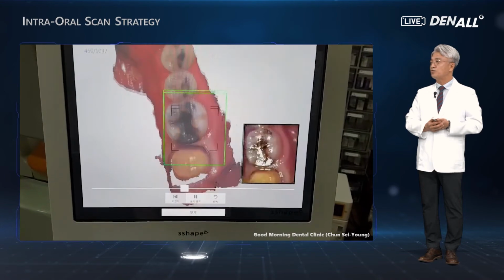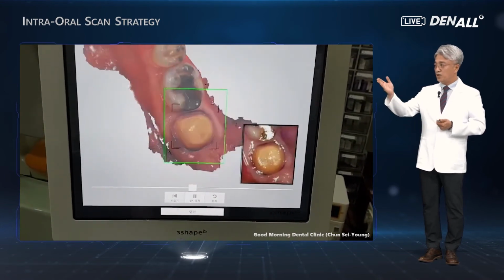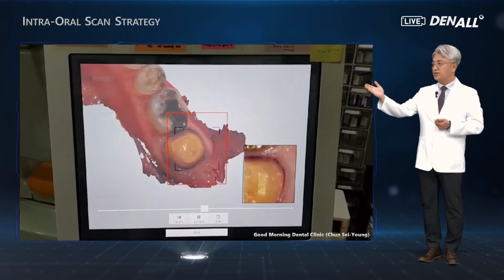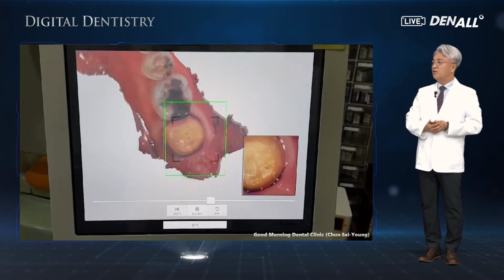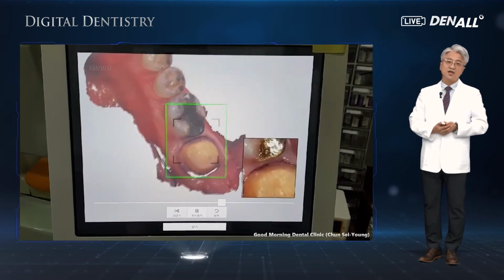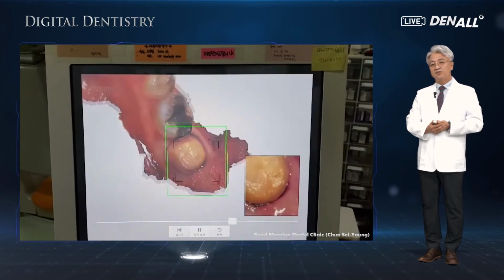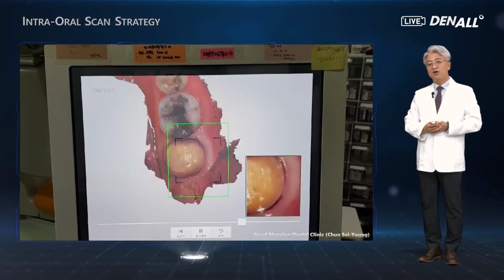Before scanning that portion, articulation paper is used to get articulation marks, and that is measured first. And the lingual and distal margins are not scanned properly, therefore the scanning should be repeated to get a clear margin in that part. So this required a lot of effort.